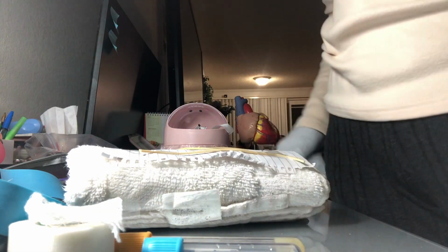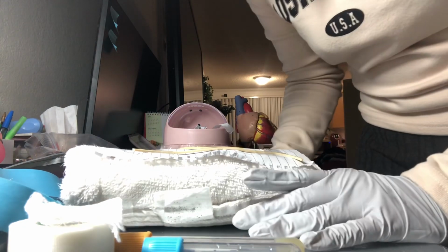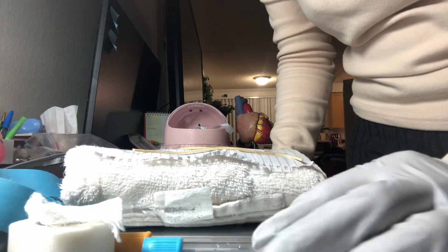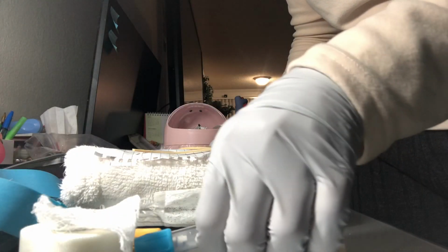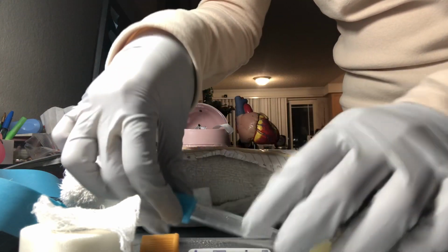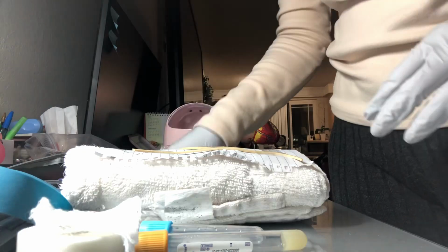So while waiting for the alcohol to dry, I'm going to set up my supply. I have my two tubes collected in the order of draw, and my needle.